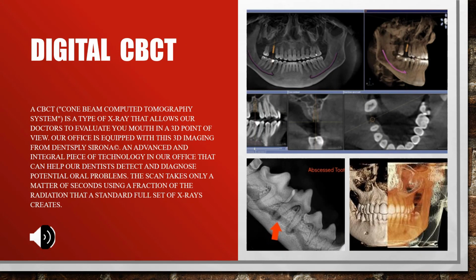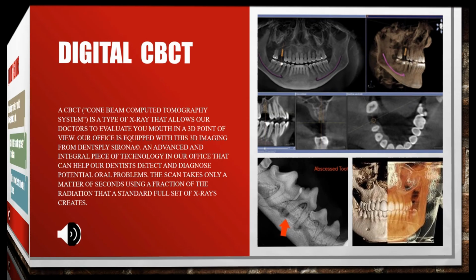Digital x-rays, known as CBCT, cone beam computed tomography, is an x-ray which is more commonly being used. This presents us with a 3D point of view and may be useful in identifying a number of potential issues as well as being diagnostic for treatment planning. This allows us to identify bone density for implant placement as well as a number of other issues, which may be abscesses within the patient's mouth, but also various defects within the bone itself.